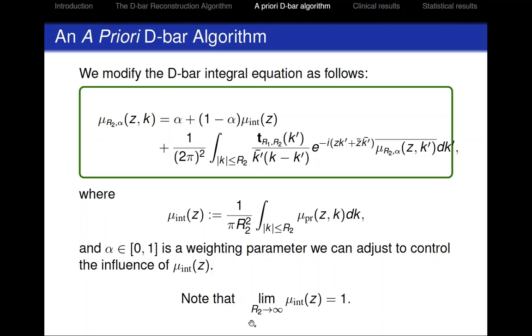Do you ever have to worry about the presence of discrete spectrum of eigenvalues as opposed to continuous spectrum? No, you don't. In this particular method, if you go back to Nachman's global uniqueness proof, he showed that there's no exceptional points for conductivities, period. So the Schrodinger equation doesn't have any exceptional points for this type of potential that arises from conductivities. They're called conductivity type potentials.